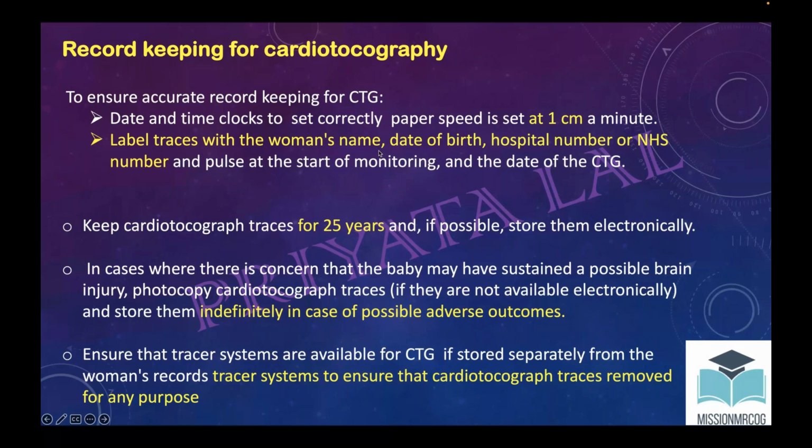How many years do you think the CTG is to be kept? 25 years, electronically stored. Now, this question comes in the exam: if the delivery is there and the baby has got hypoxia or comes out with some trouble, how long does the CTG have to be kept? Indefinitely. If there is any possible adverse outcome, you have to keep the CTG trace for the whole life.